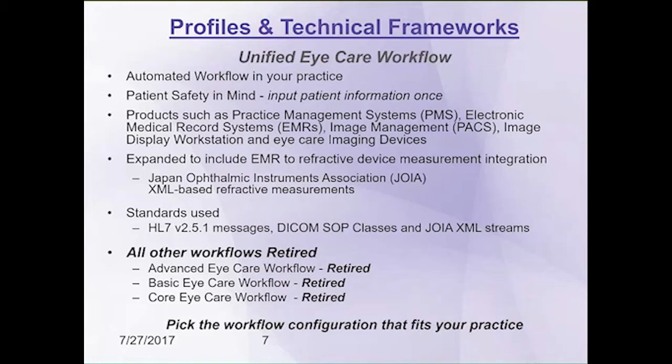We've also, as Peter mentioned, expanded to include refractive devices, and that's going to be the Joya. We did define workflows earlier as part of the process, and they've all been retired. What we've done is we've learned lessons in the past, and we've unified to one workflow.